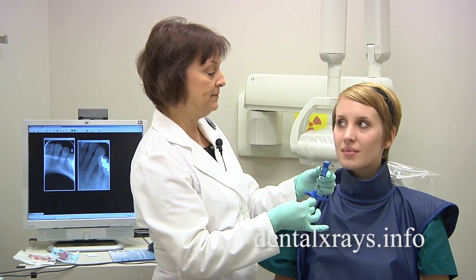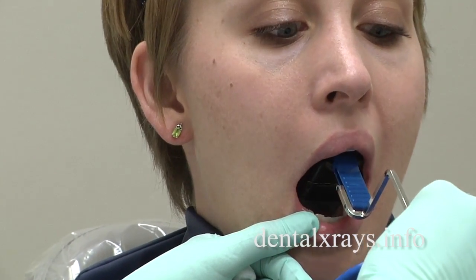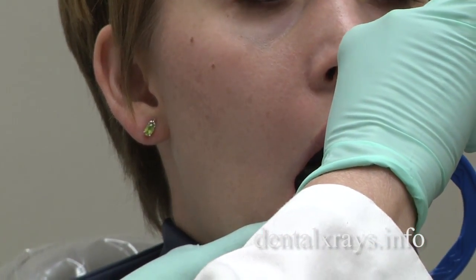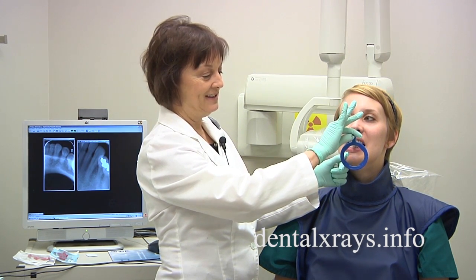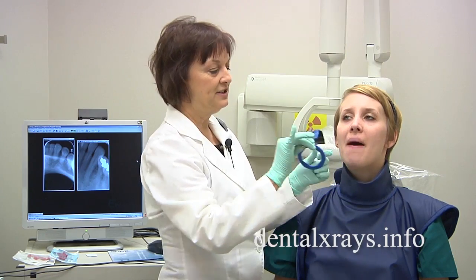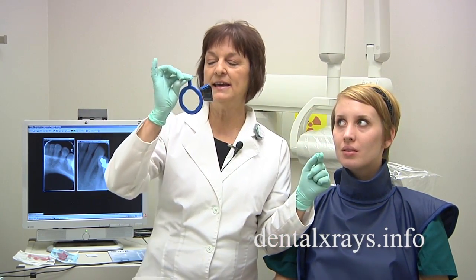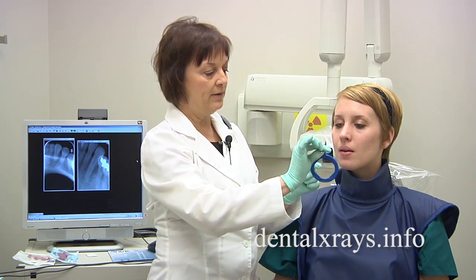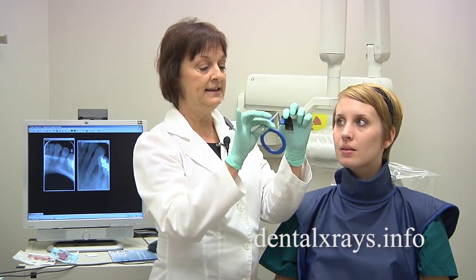Another error people sometimes make is when they place it here, they slide it up and hold it up. When the patient tries to close, it's difficult — it's jabbing down below and you're not allowing it to find its way. So let go of the bar as she's closing and it'll ease into place.